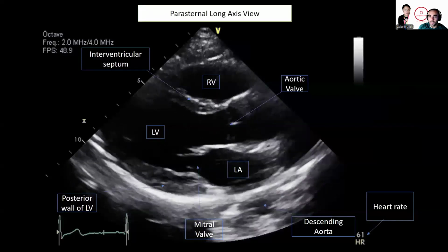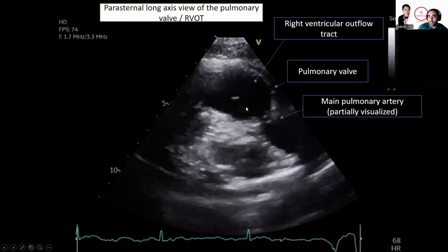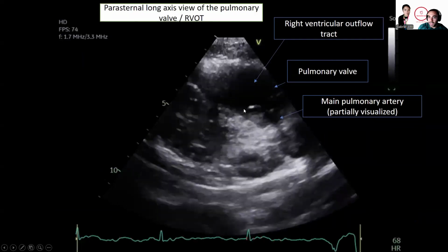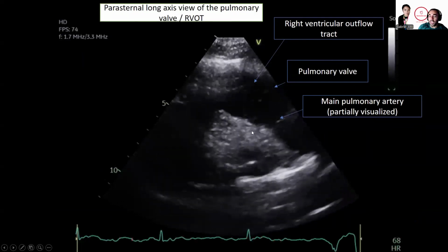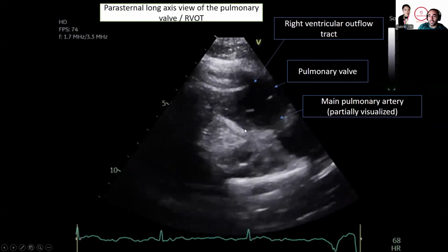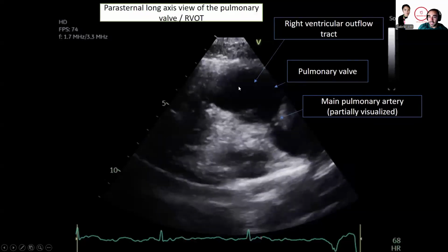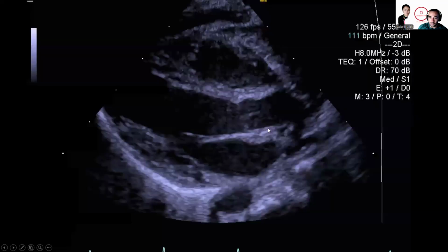So here we see the pulmonary valve, which has 3 leaflets, but in here we see only 2 of its leaflets. And we can see these very thin-walled leaflets opening and closing. And so that's a good view to appreciate if the pulmonary valve is opening and closing. And in a more advanced application, if we put color over it, which indicates blood flow directionality, you may see blood flow originating before the valve and going through the valve. If you go through the website, there are many examples of that.